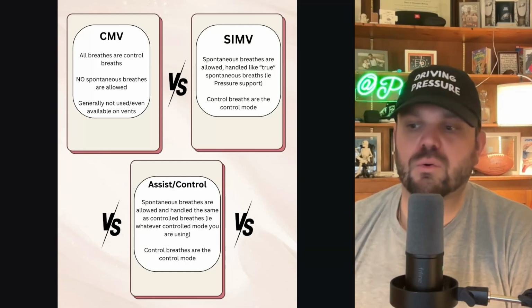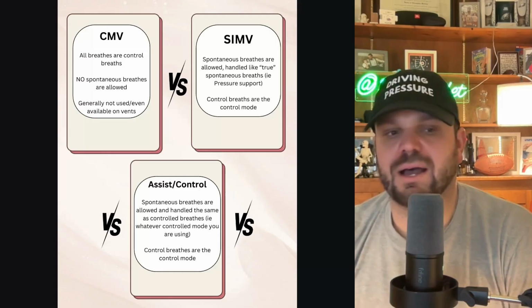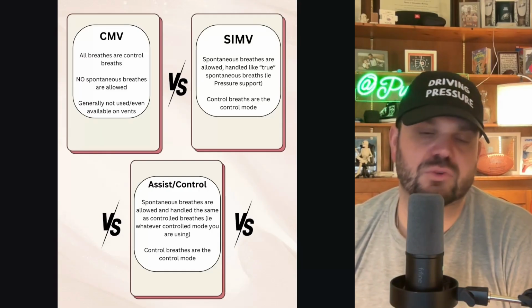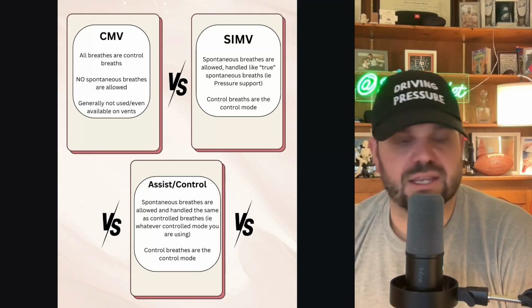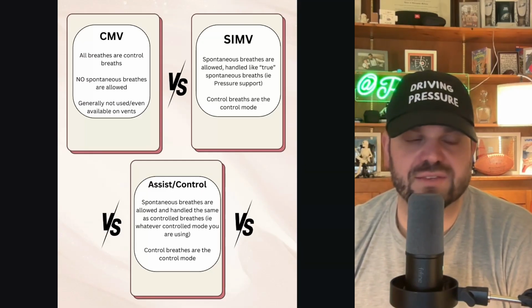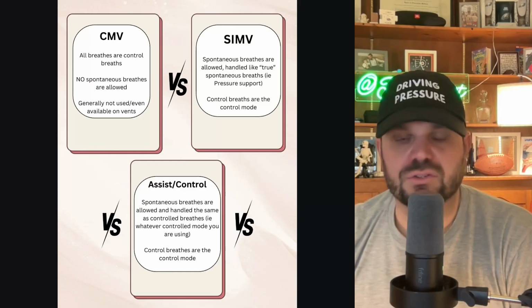So, quick drop-in pod to clear that up. I thought it'd be easier to do it this way instead of having a long post, because it gets lost in the weeds on what exactly we're talking about, because some people seem to think SIMV is still a good mode. There's other things you can do.